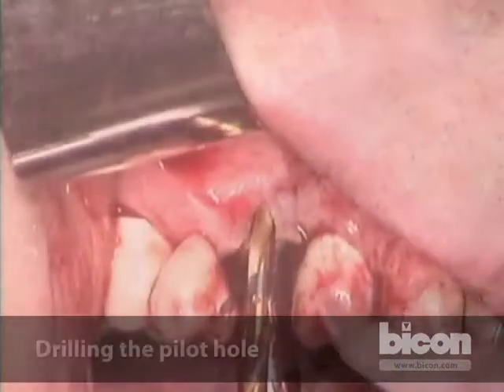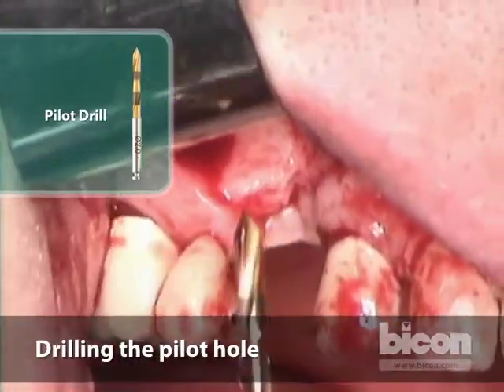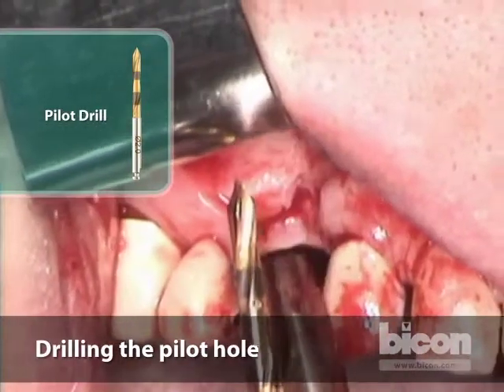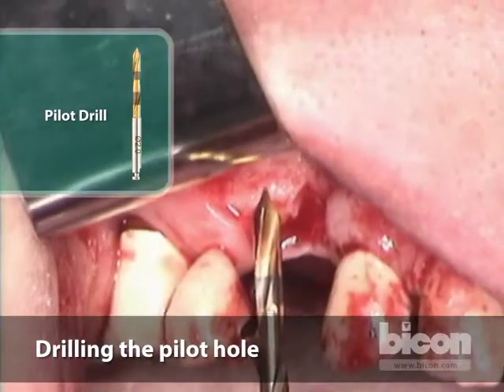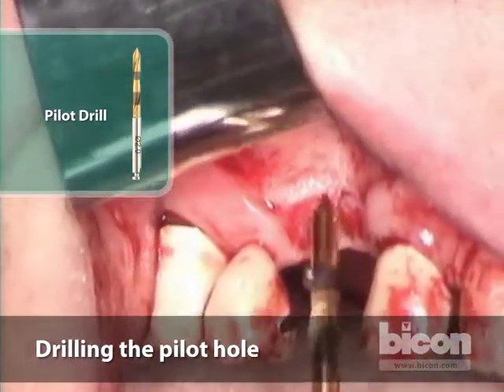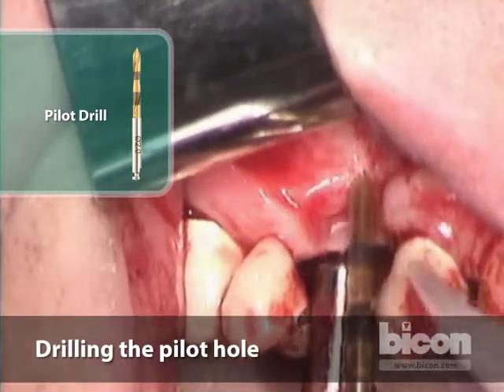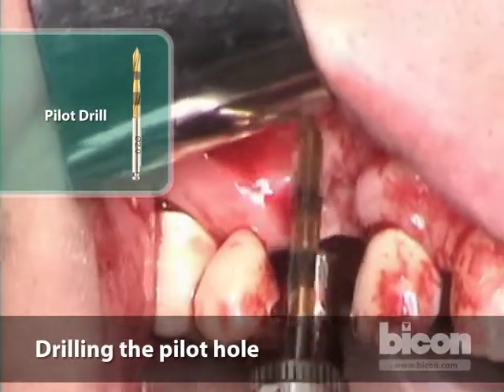The markings on the Bicon pilot drill are 2 laser-etched bands, and the first one starts at 6 and ends at 8, and the second one starts at 11 and ends at 14.